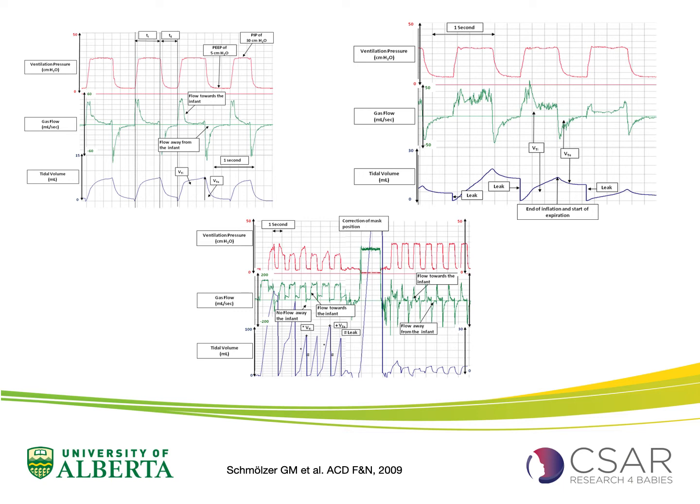And now what you can see is that the tidal volume goes in, then abrupt, because the I time is over, the flow is resetting to expiration. You see the concave waveform of the expiratory volume, and then you see a straight line resetting to go to zero because the next inflation starts. Now, the main question is, okay, I can see there is a leak, but you can see that the straight line where the tidal volume resets is at different sizes, at different heights.